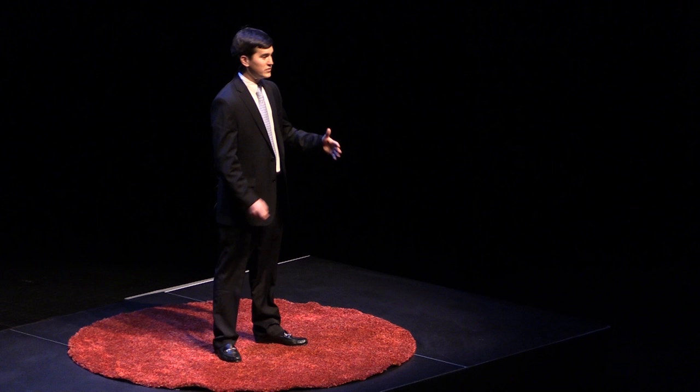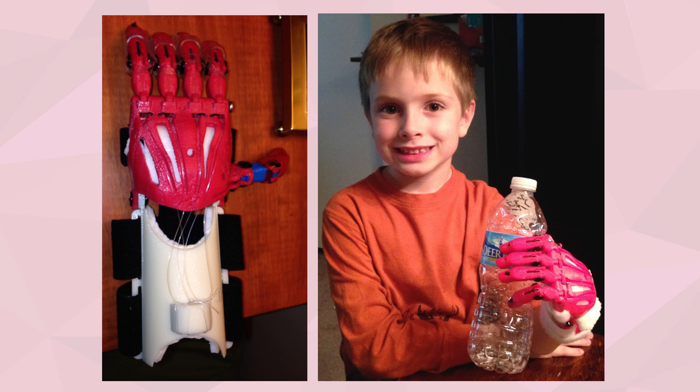The Cyborg Beast is an open source prosthetic hand created by Jorge Zuniga's research group at Creighton University. By the end of the summer, we got Holden one of these hands. It didn't look quite like the hand we saw online — put together with different colored parts, shabby, improvised hardware. I was honestly a little embarrassed to hand it off to him. But Holden didn't seem to care. It wasn't some big clunky metal hook that brought negative attention to him. It was his Cyborg hand — with five fingers, looking close to a real hand, but not too close. With this hand, Holden could become a transformer.